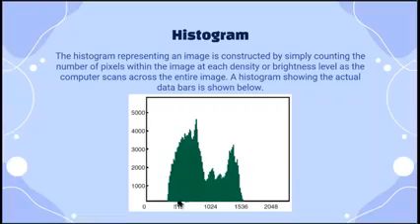So that means the color of the pixels here, or the density of the pixels, are lower in this area compared to this area here. Okay, from white to black it goes. Okay, so that means the anatomical areas here are colored black, no more black, and then this area here is white, and then it transitions towards black.